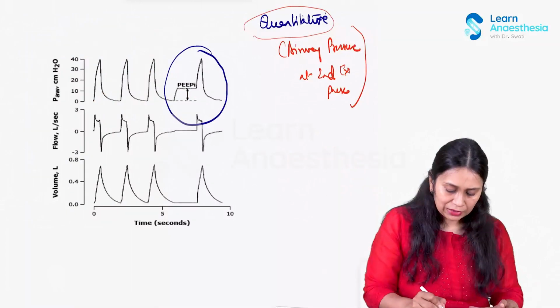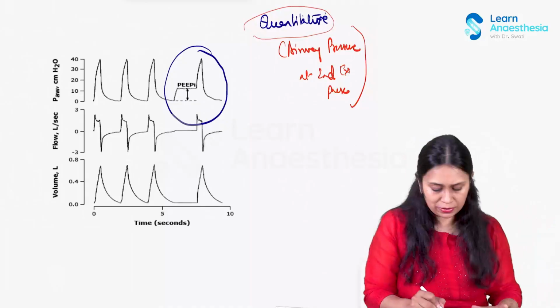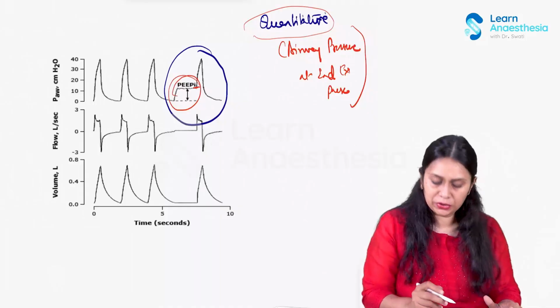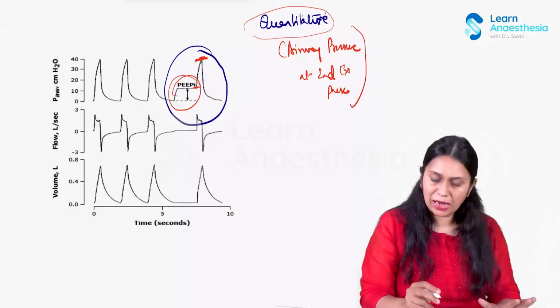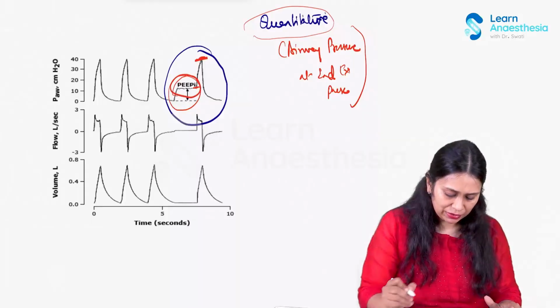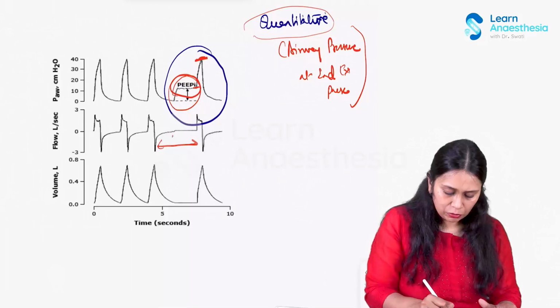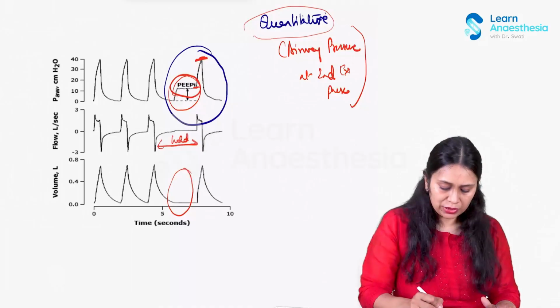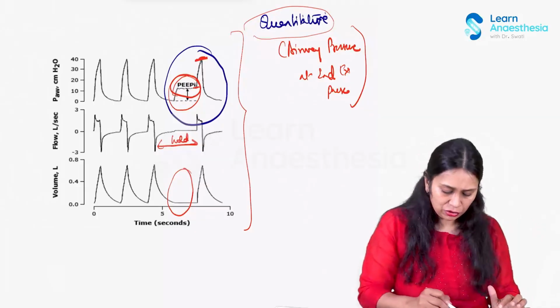So at the end of expiration, on pressing the end expiratory pause button, we can calculate this intrinsic PEEP from the airway pressure. We measure this airway pressure and subtract the applied PEEP, and we get the intrinsic PEEP value. So here there is an end expiratory hold, a hold at the end expiration. Okay, so no volume, no air is moving. At this end expiratory hold, you see these three graphs. When you press this button, your eyes should be on these three graphs.